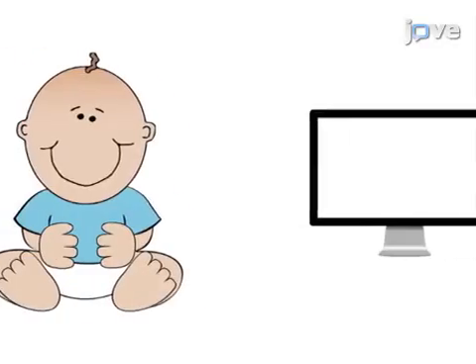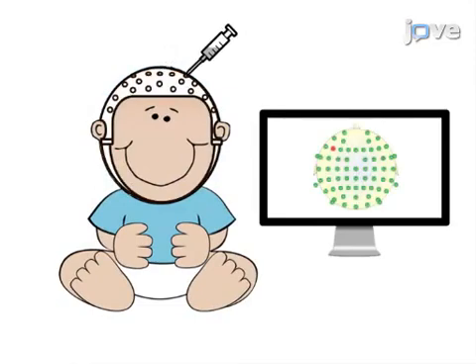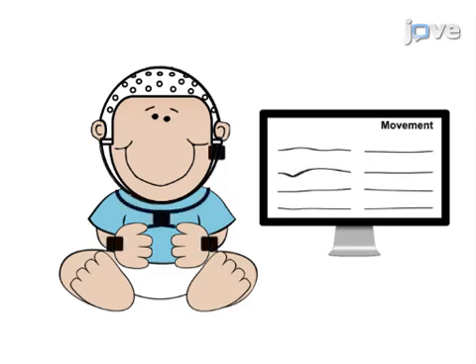This is accomplished by first placing the EEG cap on the infant's head and ensuring acceptable impedance levels between each electrode and the scalp. The second step is to secure inertial measurement units on the head, arms, and chest of the infant, as well as on the wrists of the experimenter.